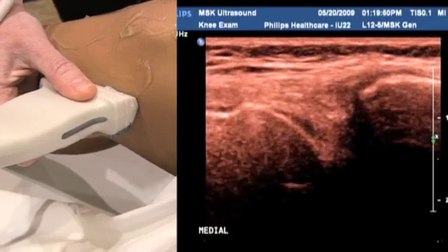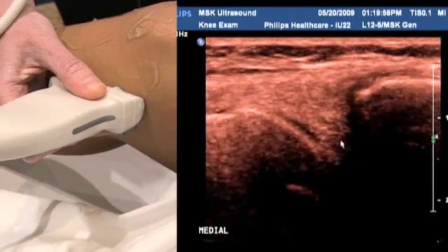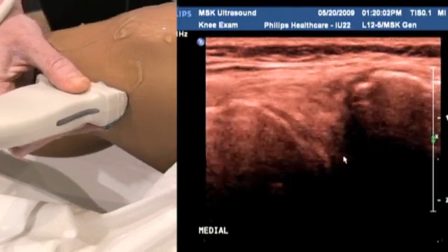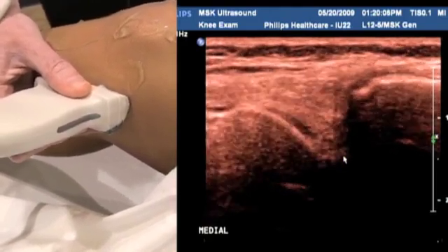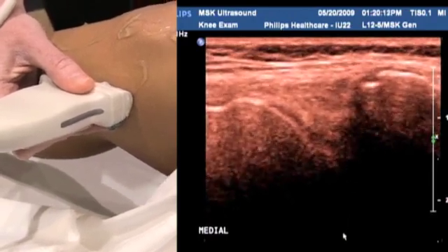And again, you can look from posteromedially at the meniscus if there's a particular area, particularly deep down, sort of deep to bone here. If that's something of particular interest clinically, then certainly you can roll the patient slightly onto their side and approach from more posteriorly. But again, I find this medial approach is quite effective in most patients.